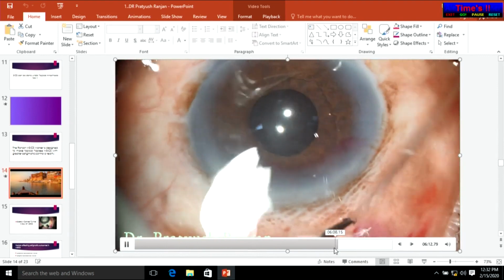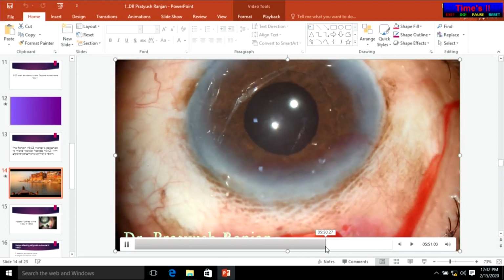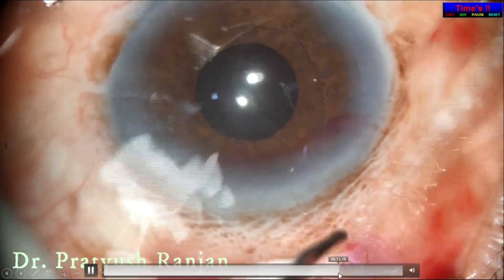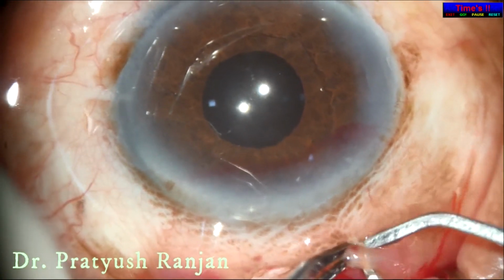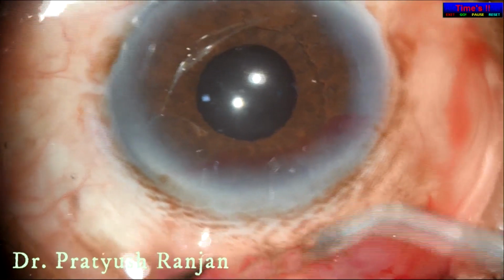See, this is how I close. Just hold both the ends and do a little bit of cautery. And SICS also, you can do without cautery, really. Bleeding takes its own time, and by the time you are through with this SICS, your whole bleeding has stopped.